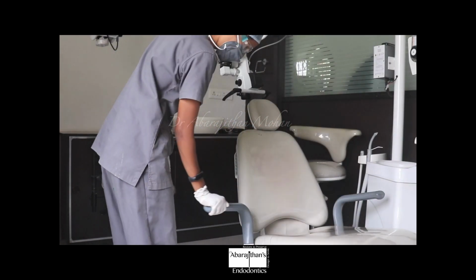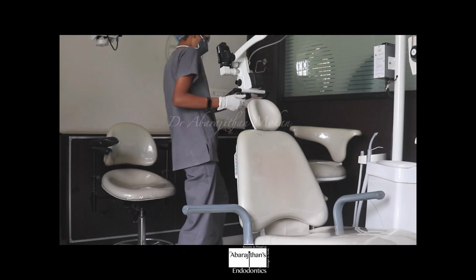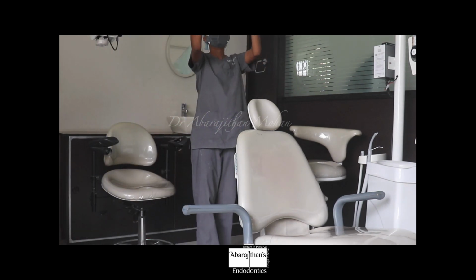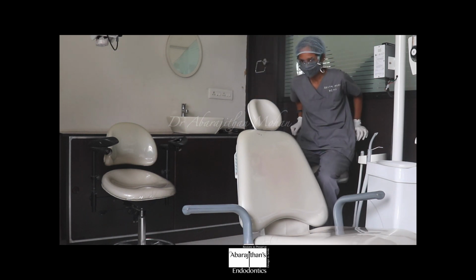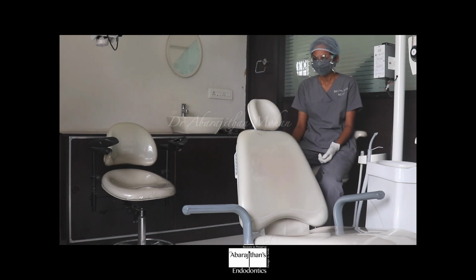You can see my assistant preparing the chair for the patient to get seated comfortably, and she's also lifting the microscope high so that there is no interference in the patient getting seated comfortably.